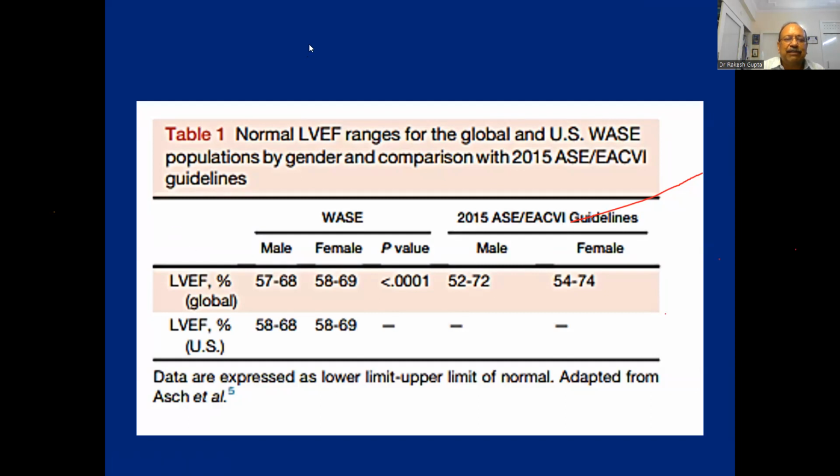Any questions I would love to take on Doppler spectrum patterns. Dr. Shilpat Kore, go ahead. Sir, there is one confusion: in which part of systole or diastole should we take the measurement for aortic, LVOT and LA? That is some amount of confusion for me.